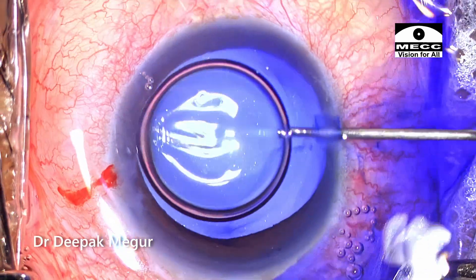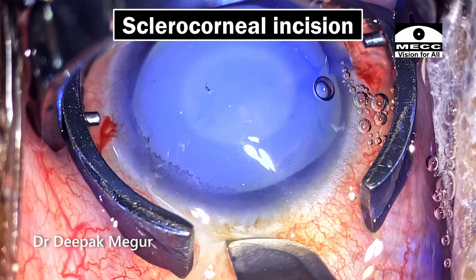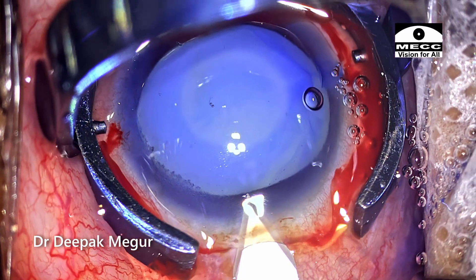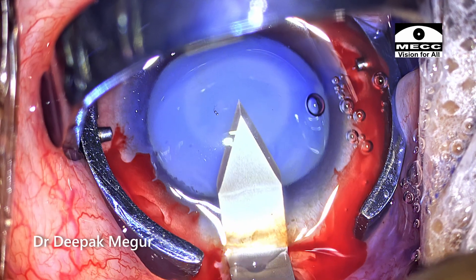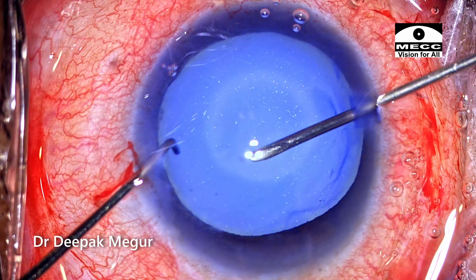The chamber is inflated with dispersive OVD after staining of the anterior capsule. I'm going to perform intentionally a sclerocorneal incision. I'm making a scleral groove and then creating a small sclerocorneal tunnel before entering into the anterior chamber. The idea is I would like to use the same incision to perform a scleral tunnel if at all there is a need to express the nucleus out manually.